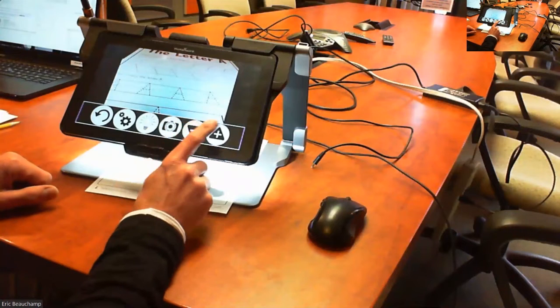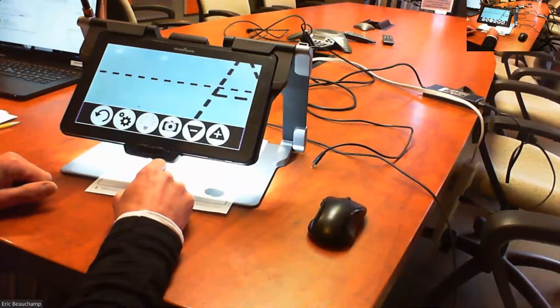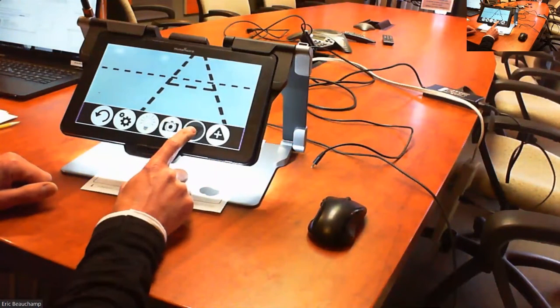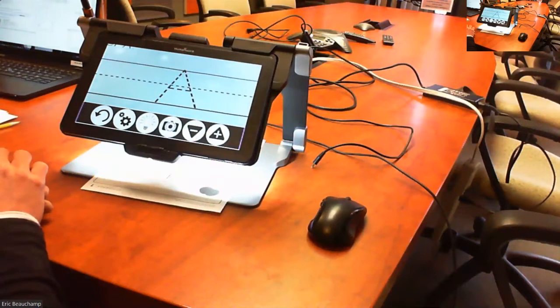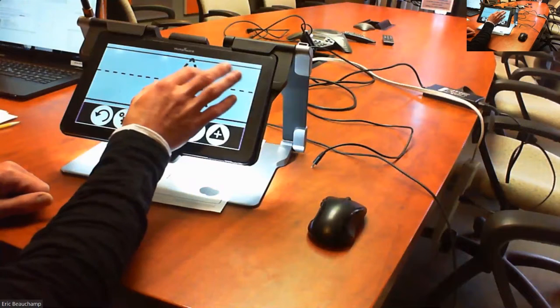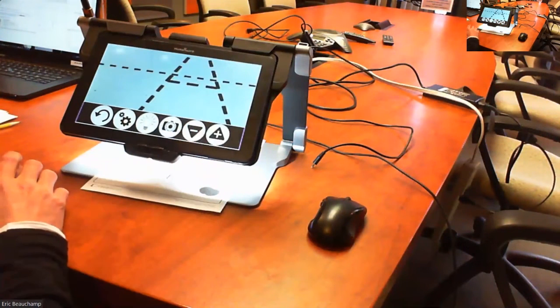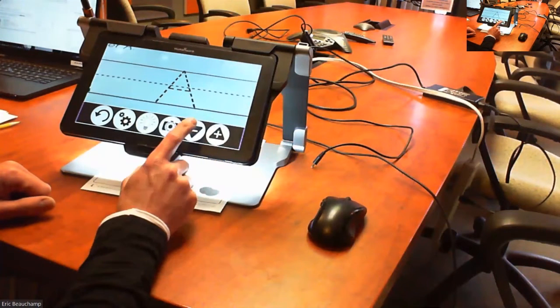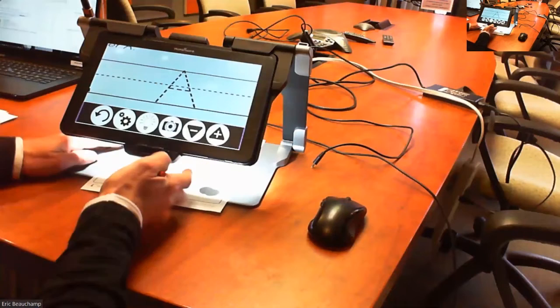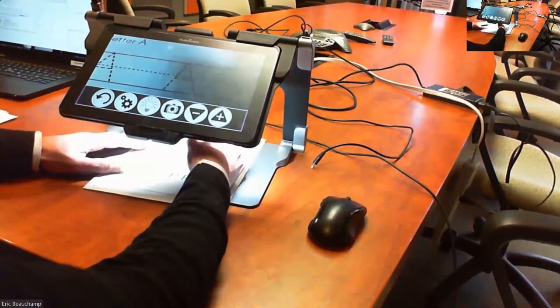The best way to use these zoom in, zoom out buttons is to keep your finger on it, and it's going to zoom in gradually inside the text that you have underneath here. And same goes for the zoom out. You can just hold that button. You can still use the pinch and zoom, but those buttons work great if you just press and hold, and it gradually zooms in. So you can adjust the magnification, and then again you can adjust the tablet for the student, and then you can start writing underneath.